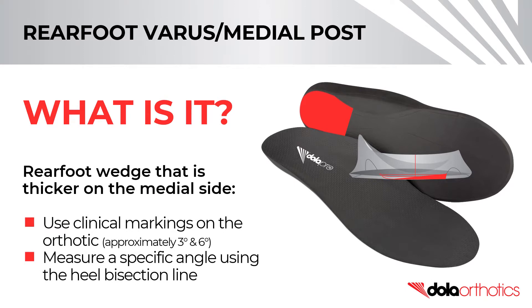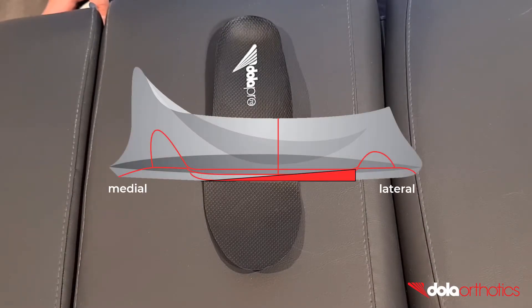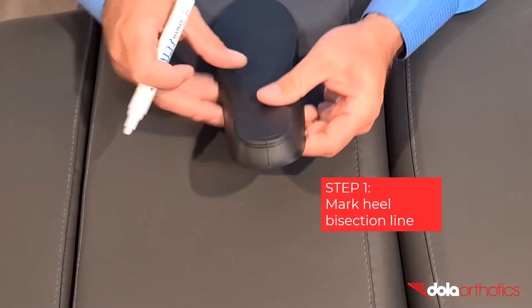Common grinds include to the rear foot post clinical markings or measured to a specified angle using the heel bisection line. In this video we will show you how to complete a 6 degree intrinsic rear foot varus grind on a full-length Dollar Pro orthotic. Step 1.